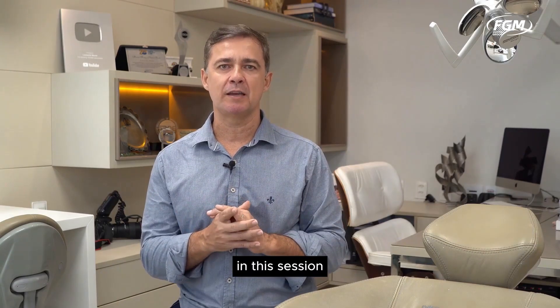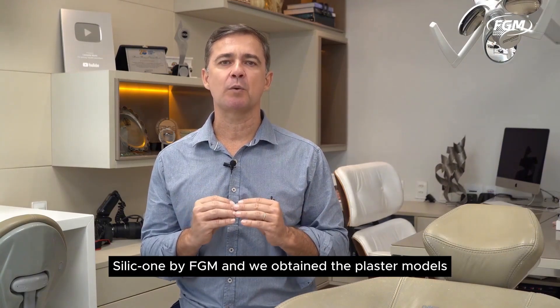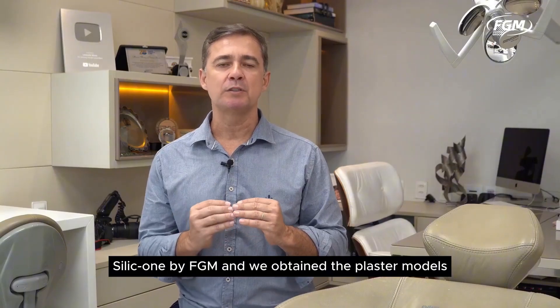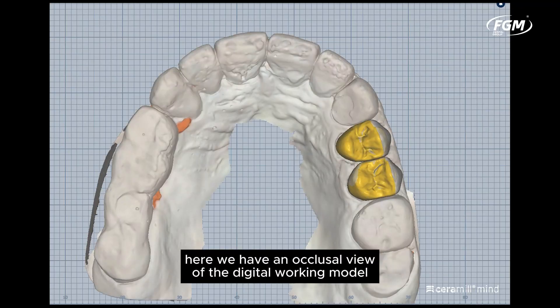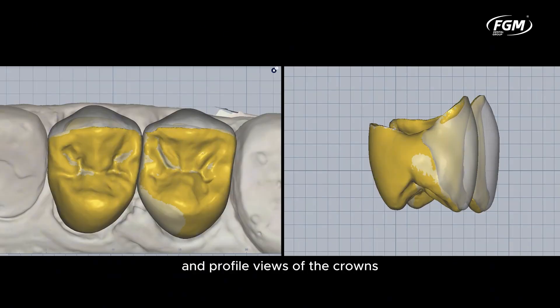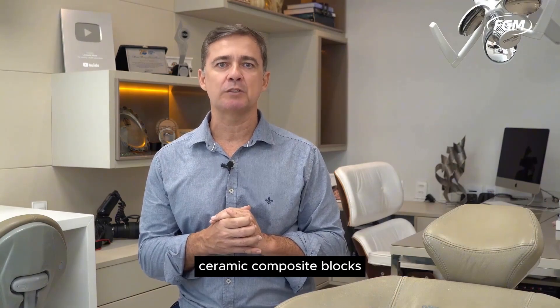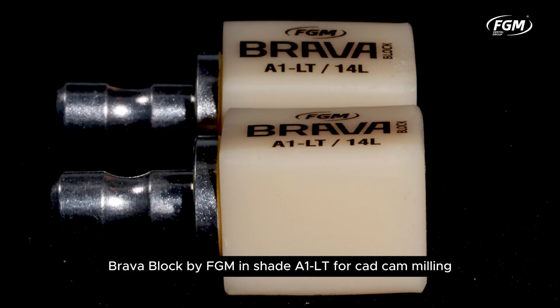In this session, impressions of both arches were taken with addition silicone by FGM, and we obtained the plaster models. Here we have an occlusal view of the digital working model obtained by scanning the plaster model. Observe the close-up images in occlusal and profile views of the crowns with vestibular reduction planned via digital workflow. The crowns were constructed from glass ceramic composite blocks, Brava block by FGM, in shade A1LT for CAD-CAM milling.